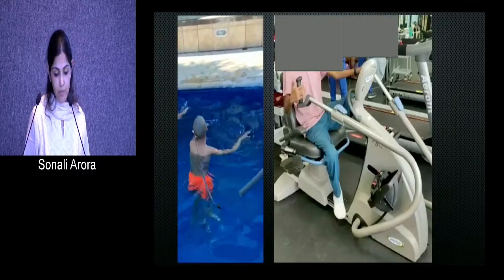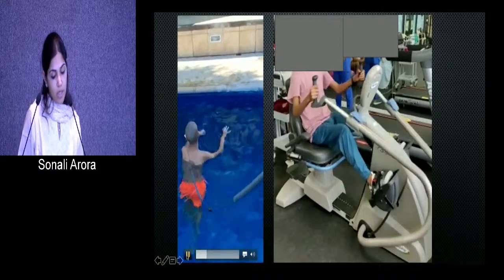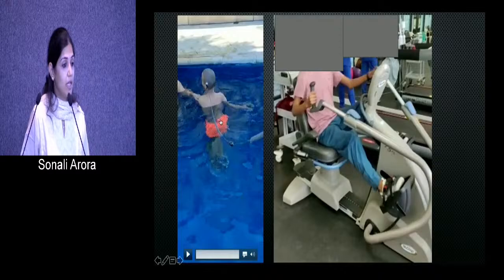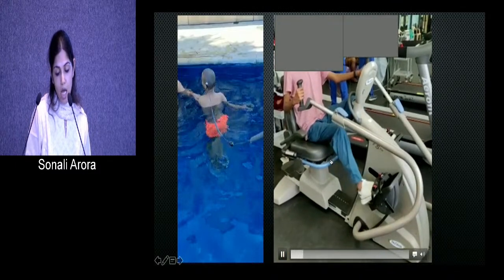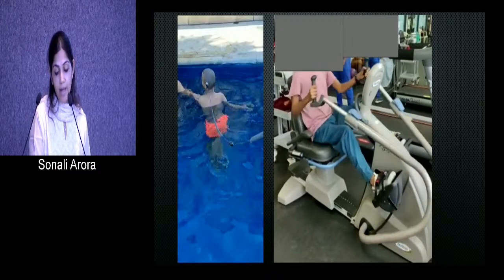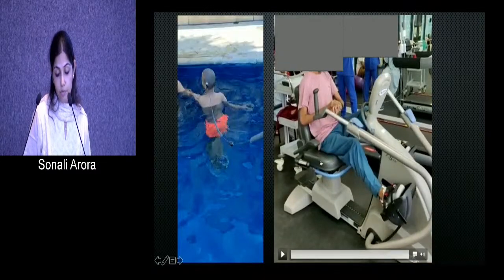On the left is one of our pediatric patients who got implanted, I think, 3 years ago, and it is a Jarvik LVAD. The driveline is here, and that's why he can swim. Otherwise, LVAD patients who have an abdominal driveline cannot swim. And this is a combined heart-lung transplant patient who was really, really sick, and this patient almost required ECMO, but thankfully we got an organ on the same night when the patient got really sick, and is doing rehabilitation in our physical rehab unit.